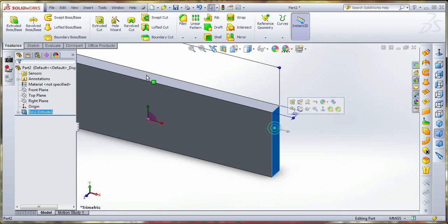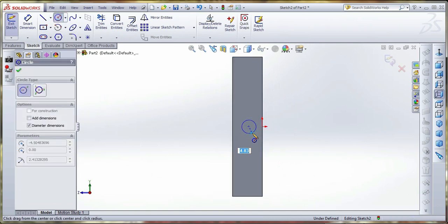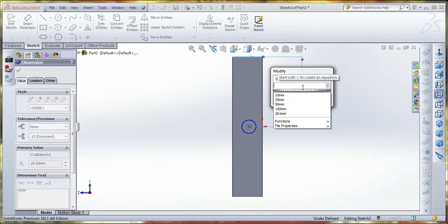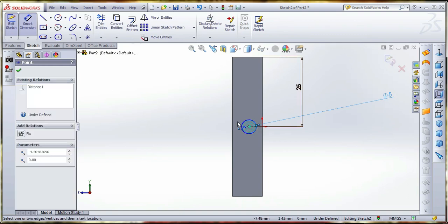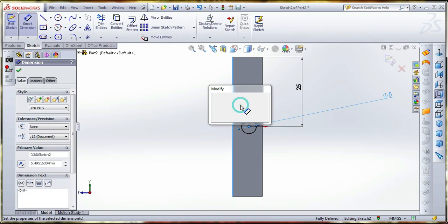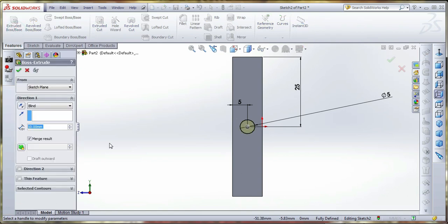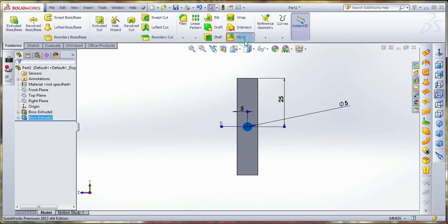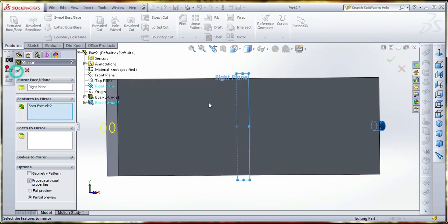And this pin we can draw. This pin is locating on the frame, the center one. The top distance is 25, the center of the step. The diameter is 5. This is also 5. Going to extrude, 5. Okay. And I'm going to mirror. Select the center datum plane, this one, the right plane.